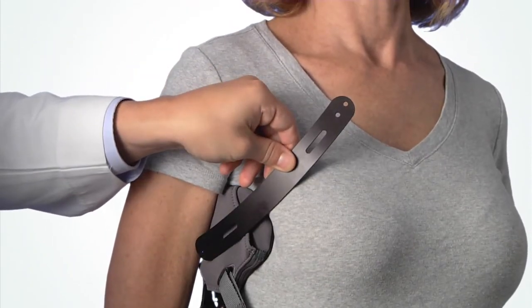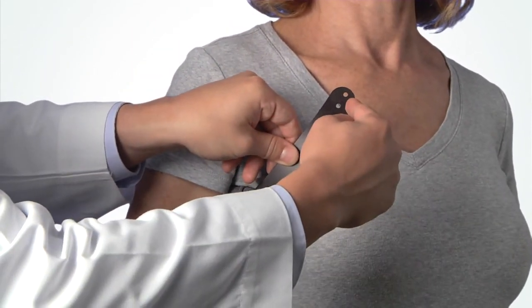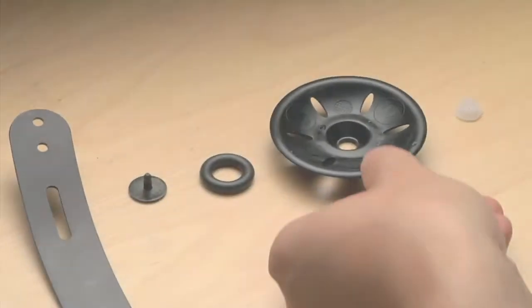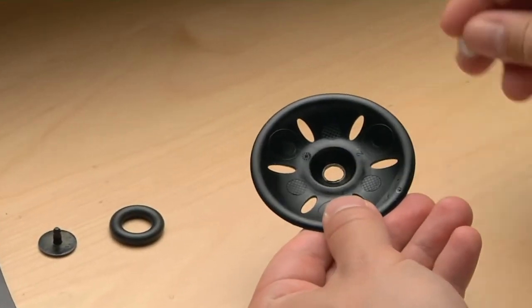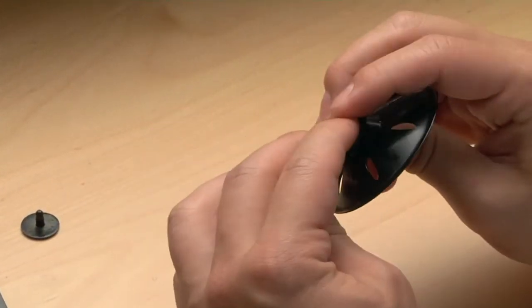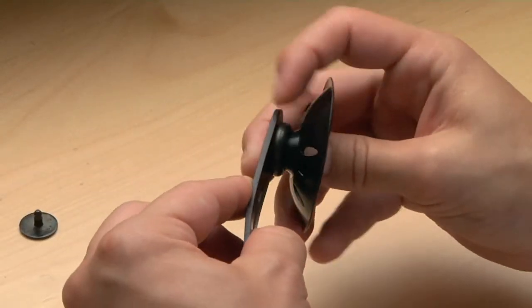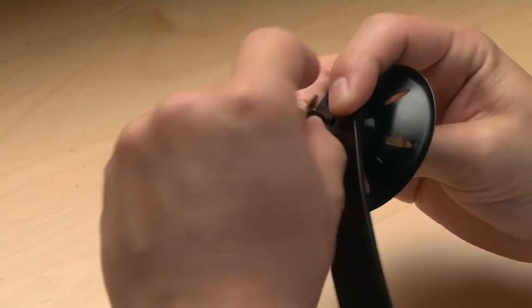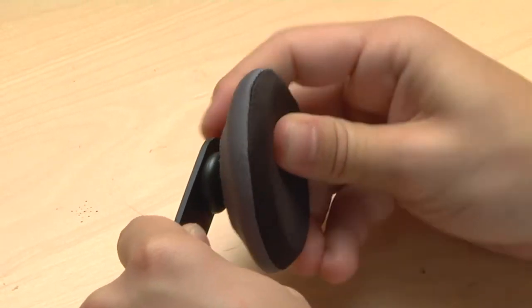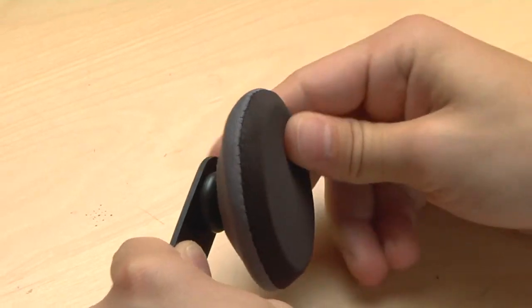If a chest pad is needed, determine which end of the universal chest strut the chest pad will be attached to. Use the male and female rivets to assemble the chest pad disk to the chest strut. Then add the foam and sleeve. Note that the chest pad pivots to accommodate varying patient anatomy.